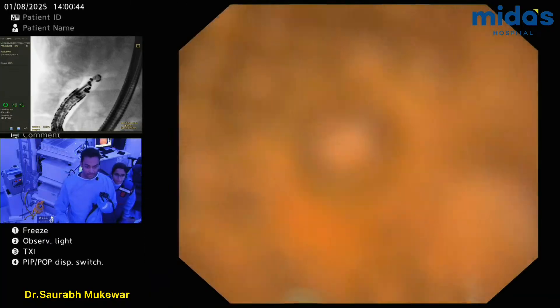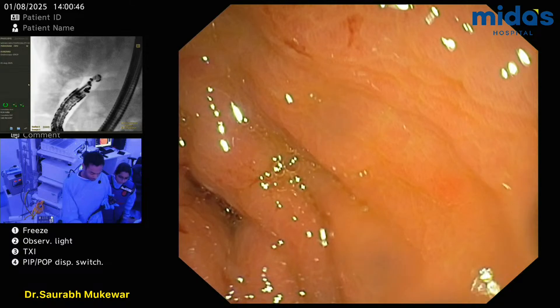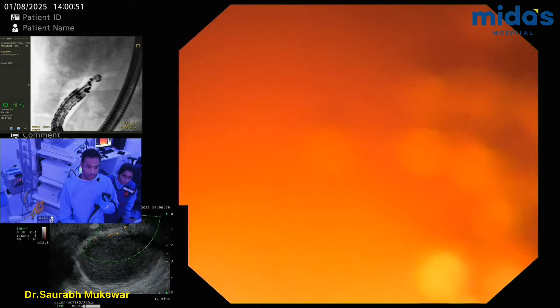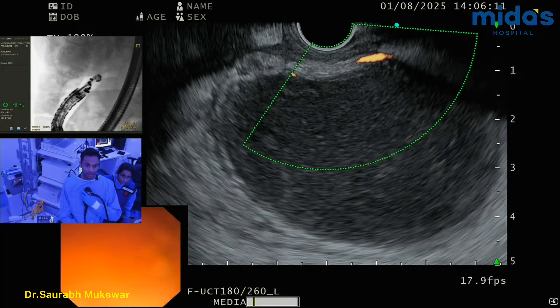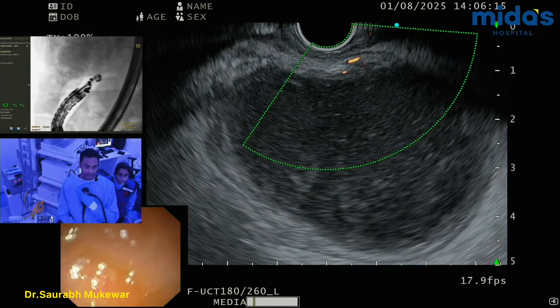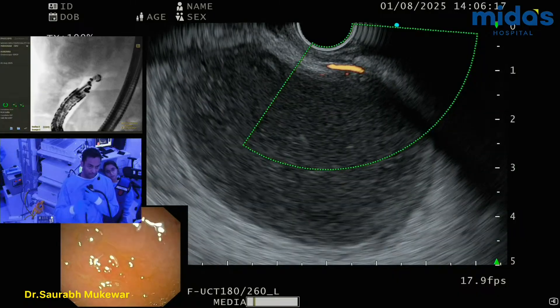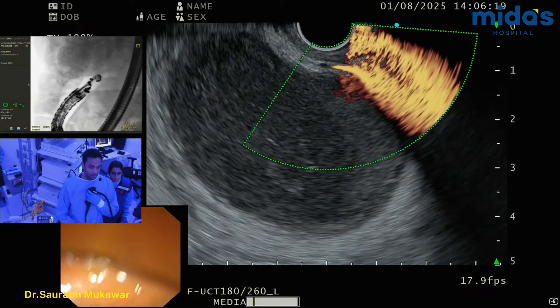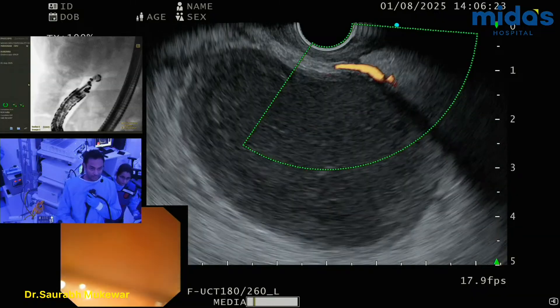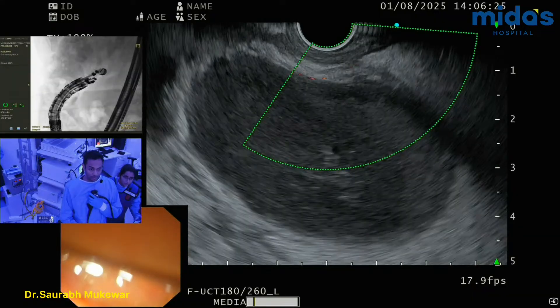Third consideration is the stability of your scope. What we want to do is sort of dig it in so it's stable — when you're pushing this thing, you're not in an unstable position. And obviously, avascular. That vessel in front of me is a big enough vessel that I don't want to hit. So you have to balance scope stability and presence of vessels while you're considering this.